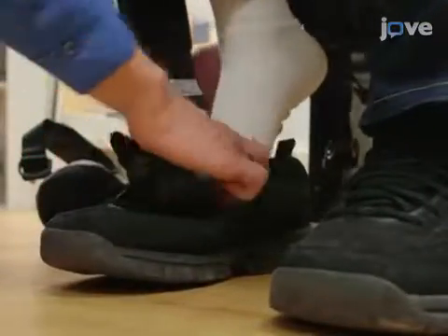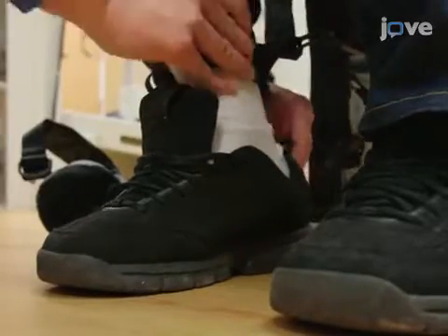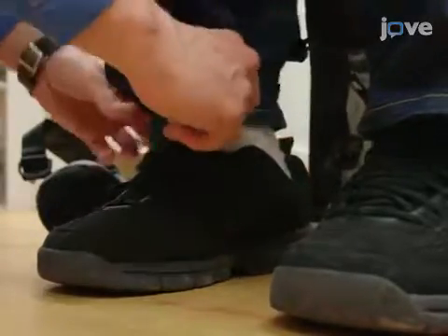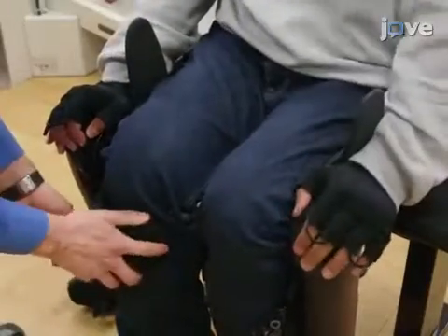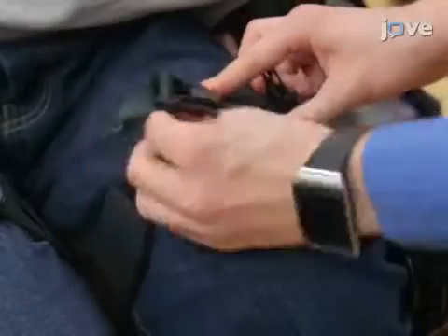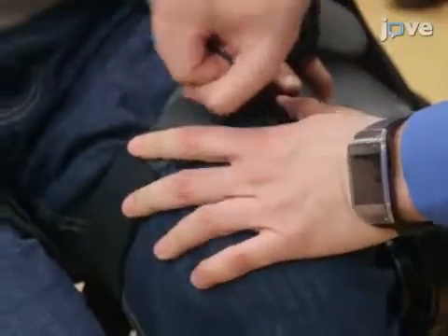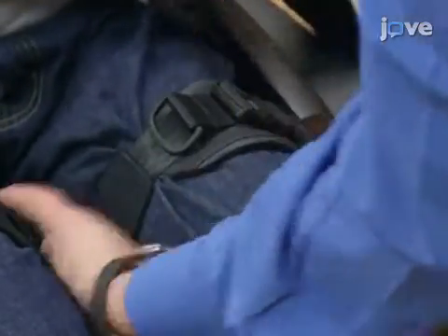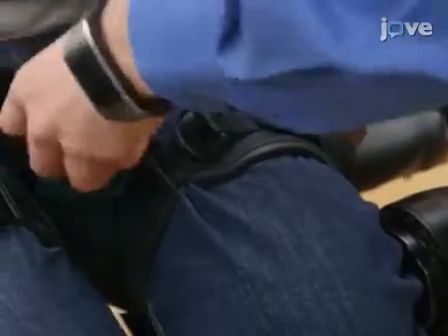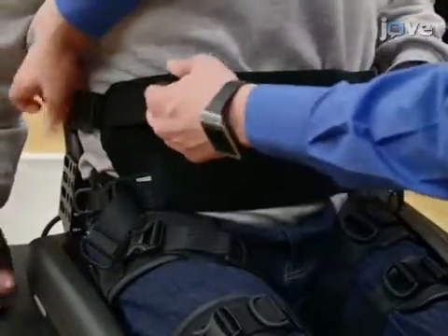Then guide the foot completely into the shoe, taking special care to ensure that the toes are not curled. After securing the feet in the shoes, secure the straps directly below the knees. Then secure the straps above the knees and those on the upper thighs, taking care to avoid crumpling any clothing beneath the straps, which may lead to unwanted friction or pressure points of contact. Finally, secure the chest strap.